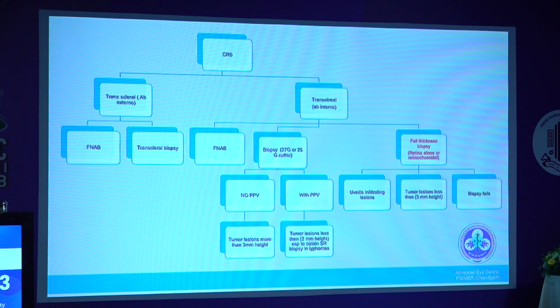If you are planning to take these retinochoroidal biopsies, you have to have a person who is going to look at these, friendly to you, nearby you, and you should be ready with the media and wherever you want to send. So if you don't have this kind of teamwork, please don't do these procedures.